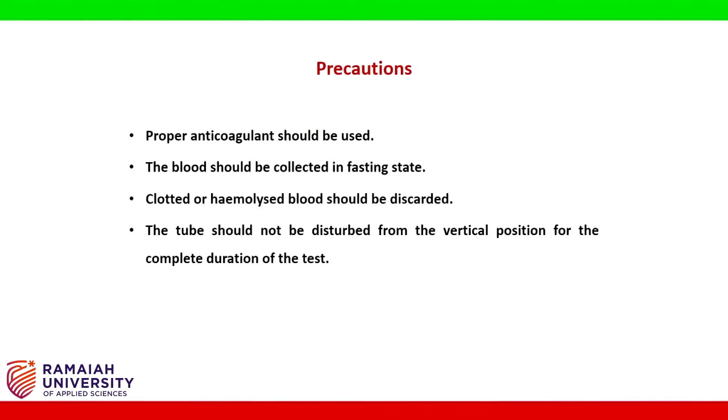Precautions: proper anticoagulant should be used. The blood should be collected in fasting state. Clotted or hemolyzed blood should be discarded. The tube should not be disturbed from the vertical position for the complete duration of the test.